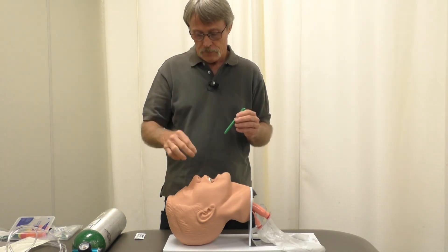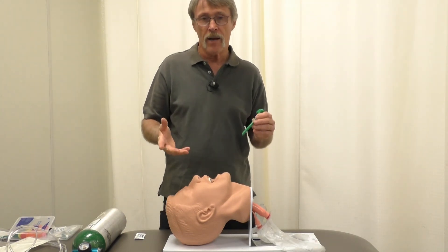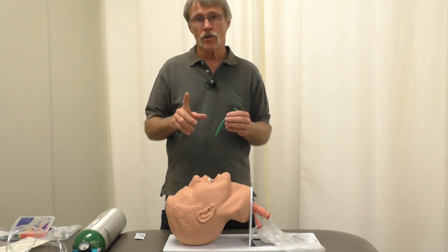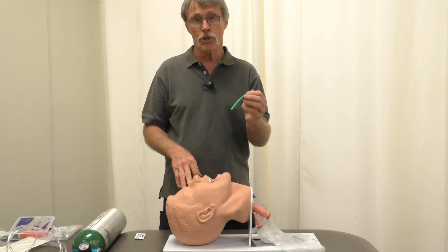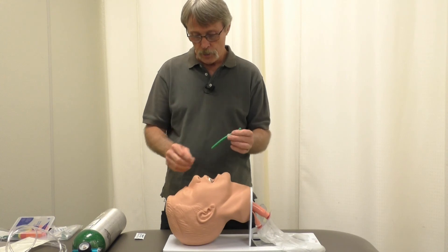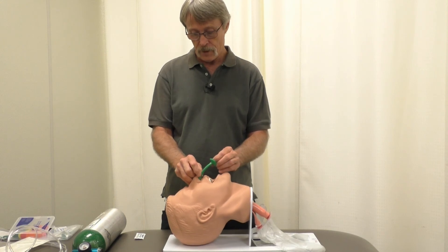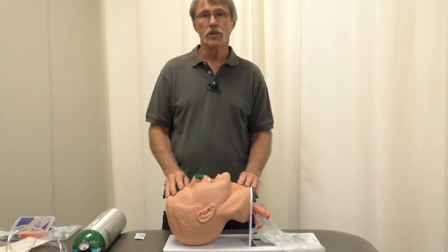It has a bevel on it and you want to position it against the septum. Usually the right nostril is bigger than the left, but take a look to confirm. A contraindication for using this is if the patient has a brain injury and you're unsure whether they have a basilar skull fracture. Once it's lubed up and you have the correct nare, feed it down into the patient's airway just like that.